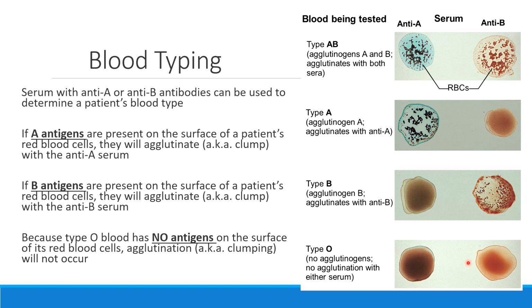As you're studying this process of blood typing, please make sure that we know what these results mean. Anytime you see clumping, that means that whatever we're testing for is present. So check to see if we're using the antibodies for the B protein. Check to see if we're using the antibodies for the A protein. And I know that this particular picture doesn't show it, but we can do the same thing with the Rh factor. We add antibodies that are looking for the Rh factor. If they find it, they're going to clump things up. If they don't find it, we won't see clumping.